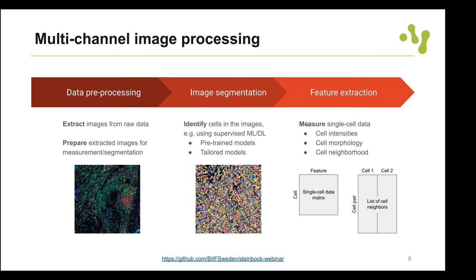This generates a graphs directory where for each image you get a GraphML file. This file can be loaded in tools like Cytoscape or Gephi where you can visualize your network in space and run classic graph analysis — clustering coefficients and so on. This is really useful because you can then use existing software for graph analysis. The software is also linked in the GitHub repository.